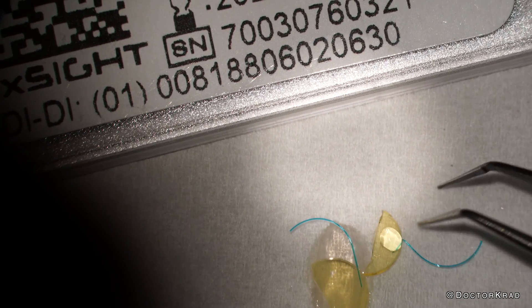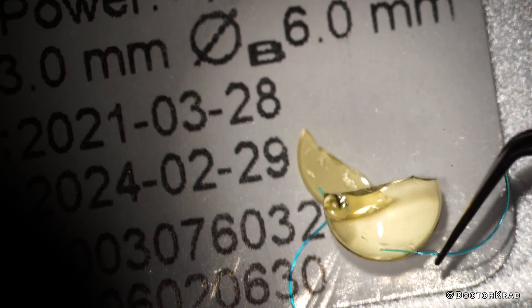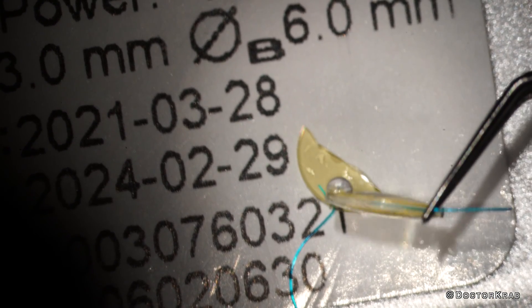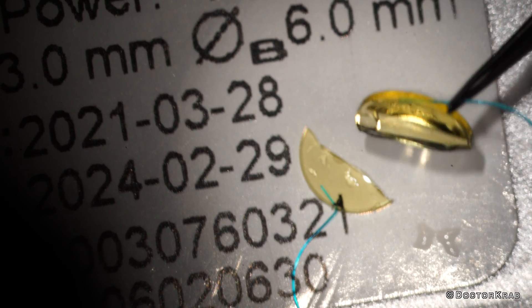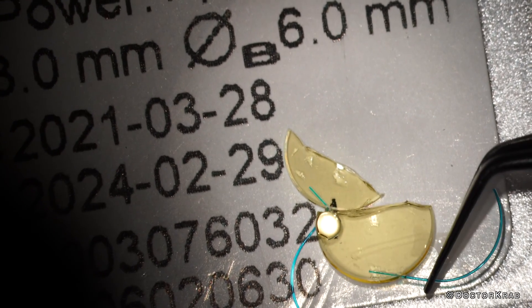So why does the Bausch & Lomb silicone lens easily go through this injector but not the light adjustable lens? It's because they're not the same silicone — the light adjustable lens material is a little bit more friable. These lenses have not been treated with the LDD device and were not stored in the normal foil casing that blocks UV light, so maybe these light adjustable lenses have no more treatable polymers. Maybe a fresh lens stored in foil would go through the EZ28 injector.